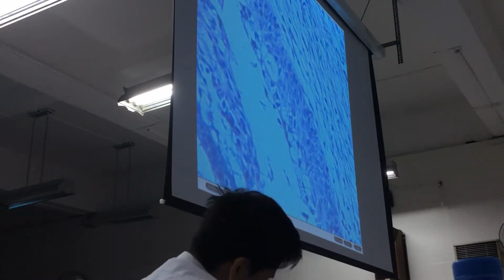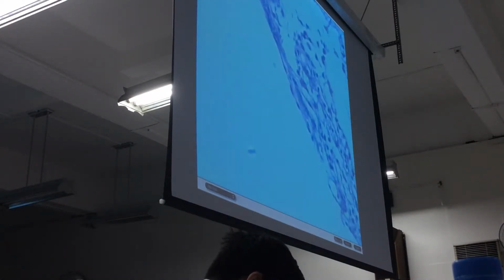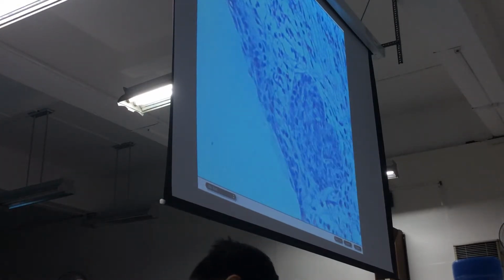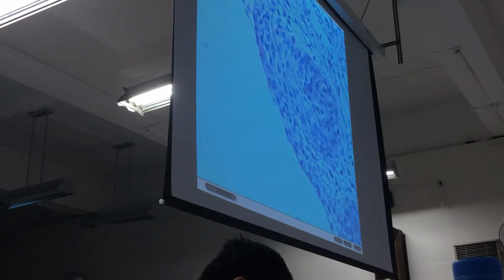You still have remnants of the endocervical cells atop the hyperplastic reserve cells, as being pointed by the teeny-weeny arrow by Dr. De La Rosa. Okay. If the reserve cell hyperplastic tissue matures, they would like to transfer to another type of epithelium, specifically stratified squamous cells, which is known to be resistant to friction and other mechanical trauma.